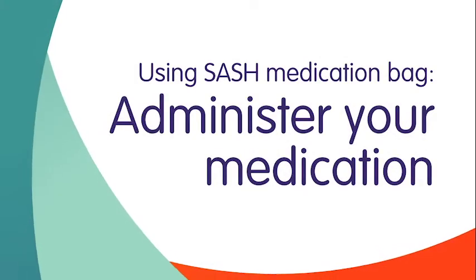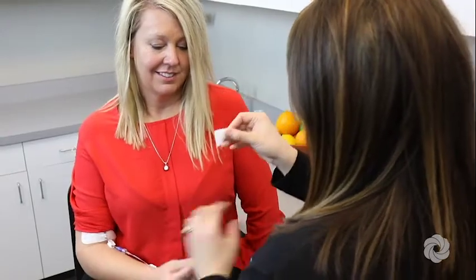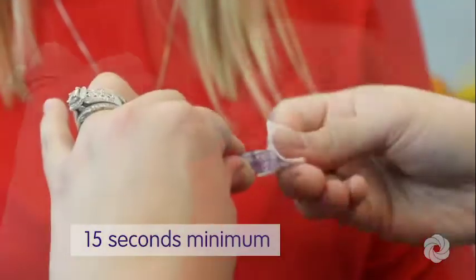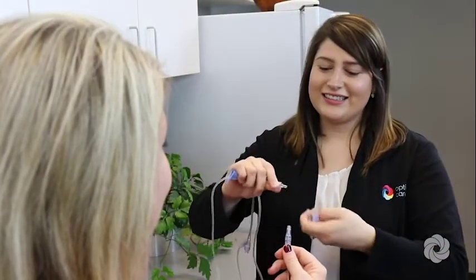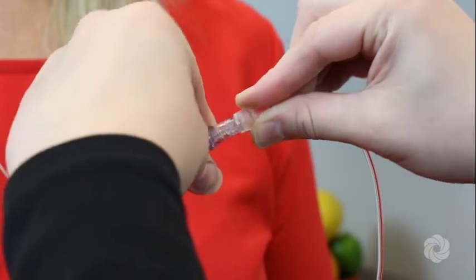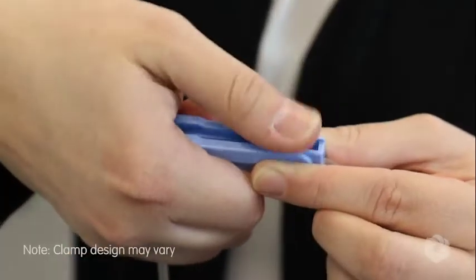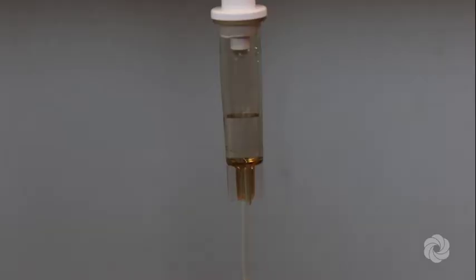You are now prepared to administer your medication. Scrub the needleless connector on your IV catheter for at least 15 seconds and allow to air dry. Remove the protective cap from the IV tubing. Attach the IV tubing firmly to the needleless connector on your IV catheter. Open the clamp on your IV catheter and/or extension set, if indicated. You should see drops fall into the drip chamber as your medication begins infusing.